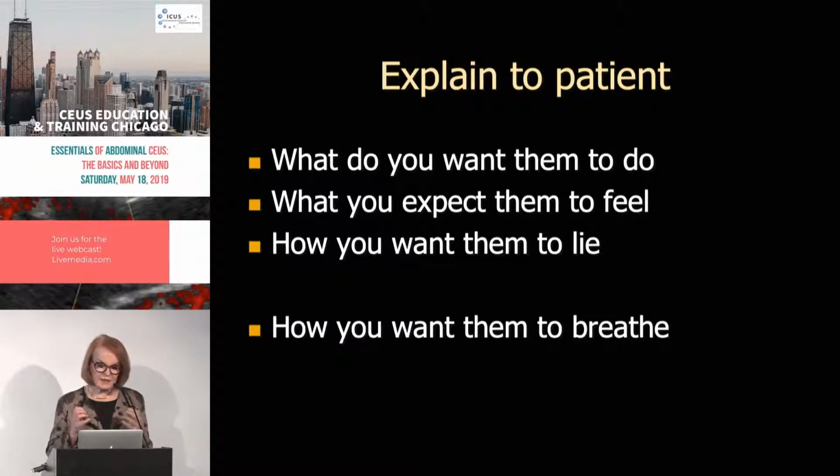Now, you also want to explain to the patient, especially if you have ethnic patients or people who aren't really in sync with you, what you want them to do. And you have to tell them what you expect them to feel. So many patients will come in and say, oh, I had a big reaction when I had a CT scan, or I had a reaction to this or that, and they're anxious. And so I say to them, really, you don't need to tell me what you've had before, because when you have this contrast, it is very likely that you will feel absolutely nothing. And so you want them to be reassured, and most patients are very reassured and do very well.